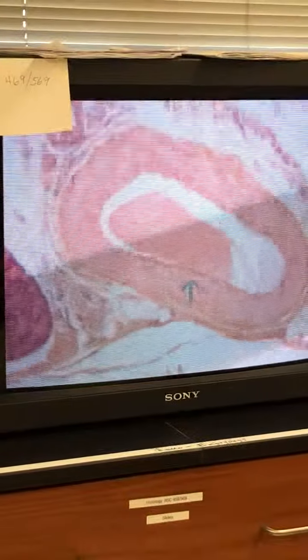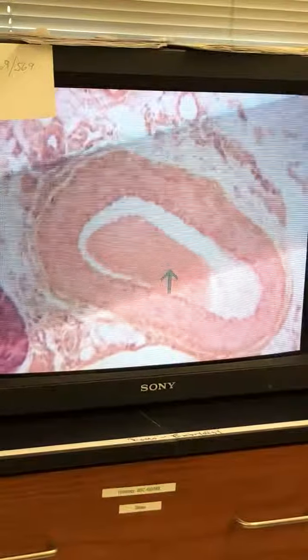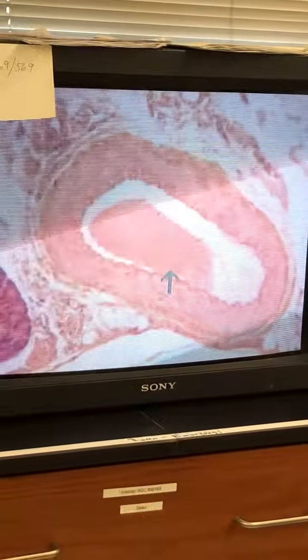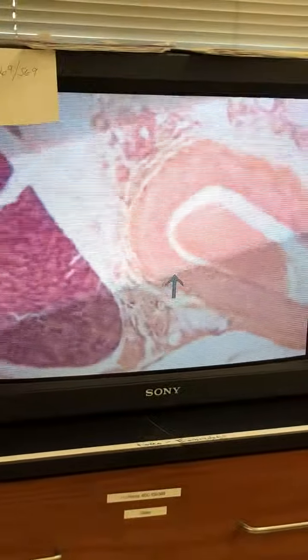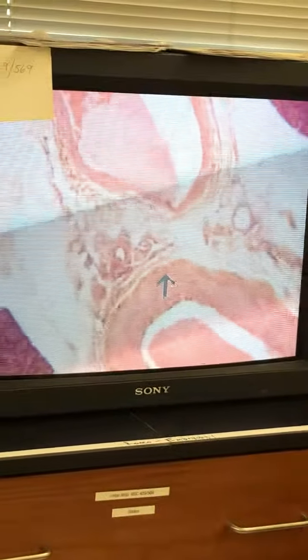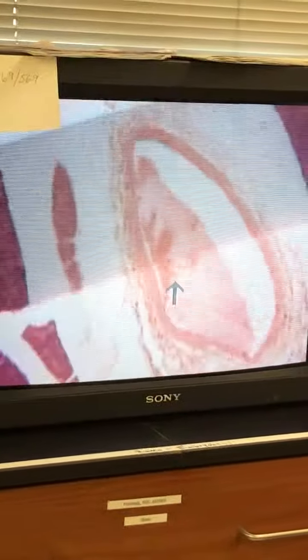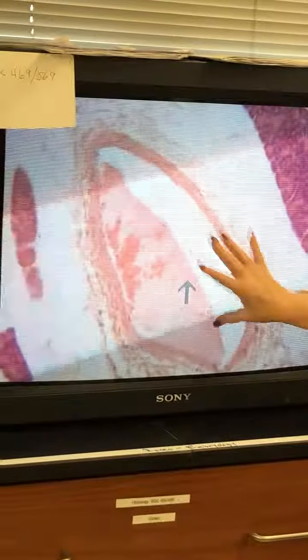Okay, so this isn't that artery-vein slide that we had. This happens to be a duodenum slide that has the pancreas sort of right with it. You can see all these vessels. I had seen this before when I was looking for something else, and I really love this slide. But what vessel is this? Name this vessel.